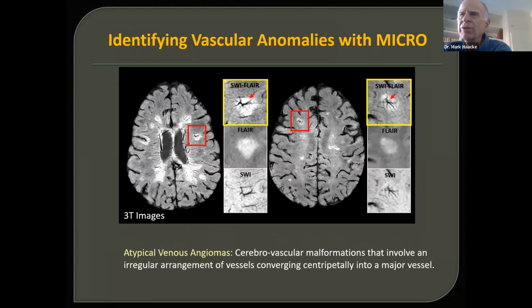I'm going to skip through some of these. Here's another example of that developmental venous angioma that may be associated with poor flow in this territory. So similar to the one I had showed you before, yet another one here. Most of these other lesions are affiliated with central vein signs. And often this territory here is among the most affected territory.